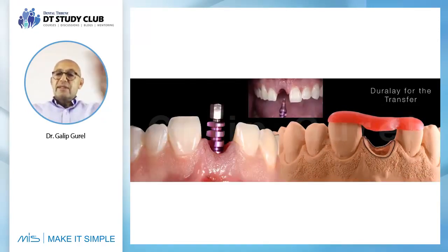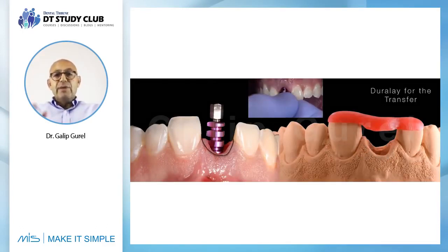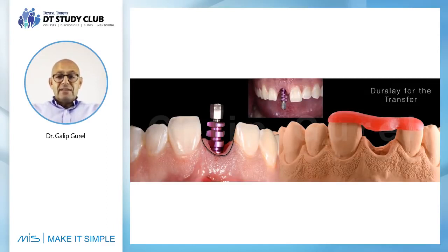And then when I carry it all the way to the left-hand side, we see that even in these few minutes, when we are placing the impression piece over the implant, look at the downsizing, the collapsing of the socket. Already it's way narrower than what we transferred into the stone model. So if we didn't do this, the final outcome would have come out as narrow as this.